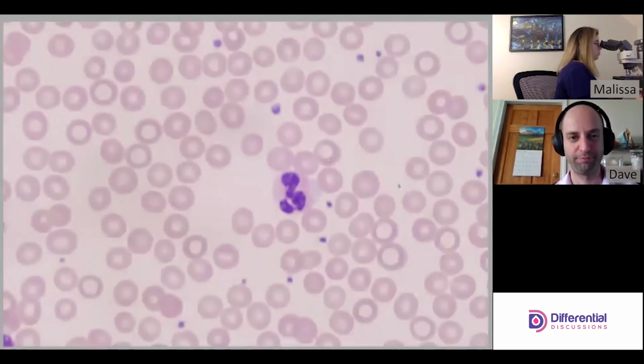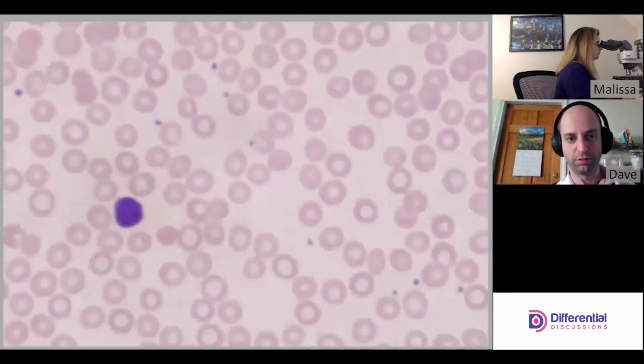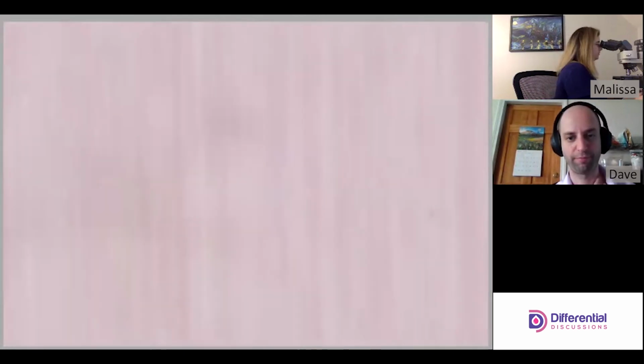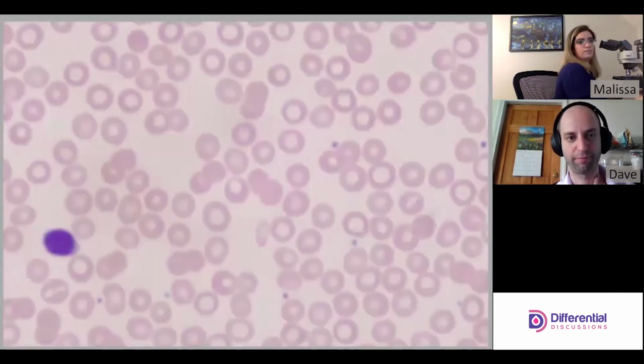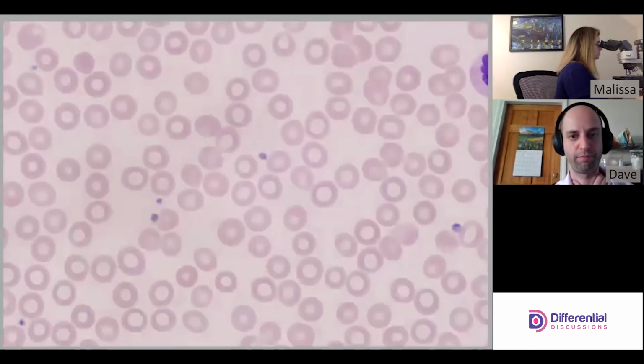Neutrophil. Lymph. Another lymph. Another lymph. Another neutrophil.